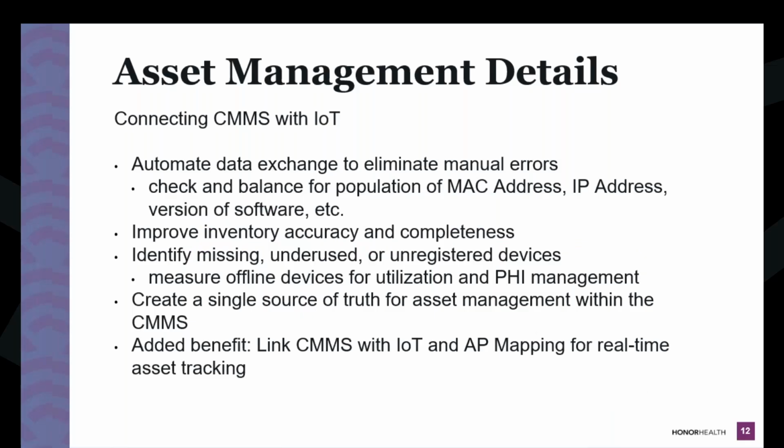So, asset management details. We are fortunate enough to have an IoT solution where we can see the traffic going between sites and between devices. What we do with that is that's coming straight from the manufacturer. It's got a serial number, it's got the MAC address, it's got all of these things that are valuable. What version of software is it on? Because when you have a recall, it could be for only a certain version of software. And so you've got to figure out where you're at.